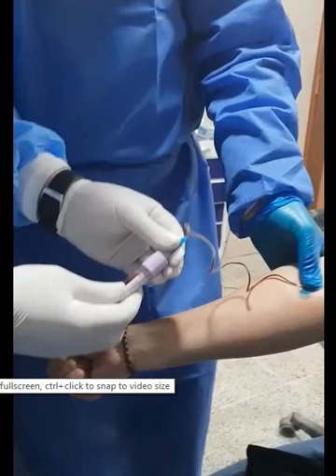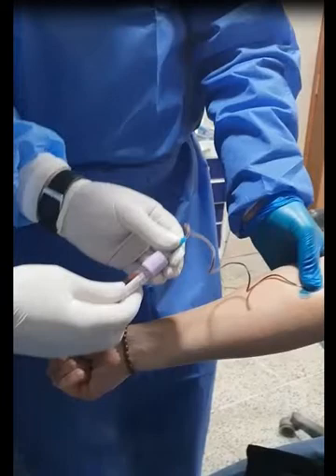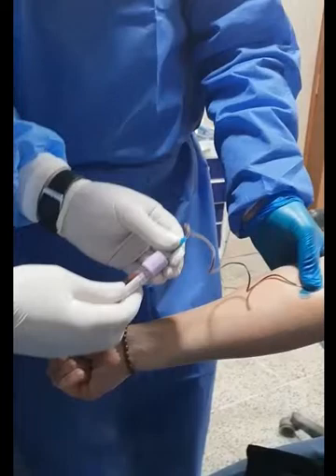Hello, my name is Dr. Harim Jaffer. I am a periodontist. Today I will share with you a clinical case in which a young lady came to my clinic with a defect in the soft tissue and bone around the dental implant. She had a gingival recession with bone loss.